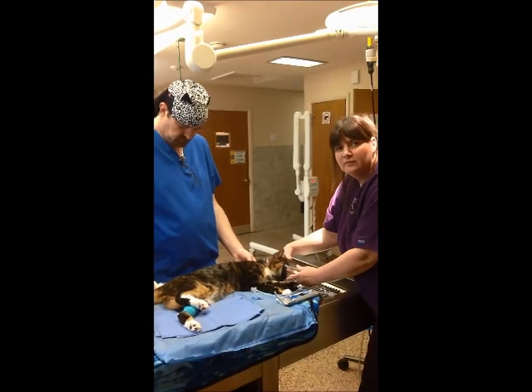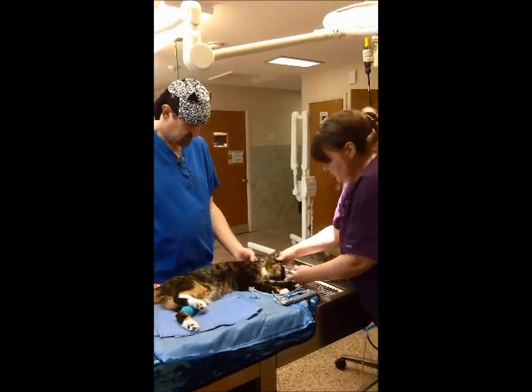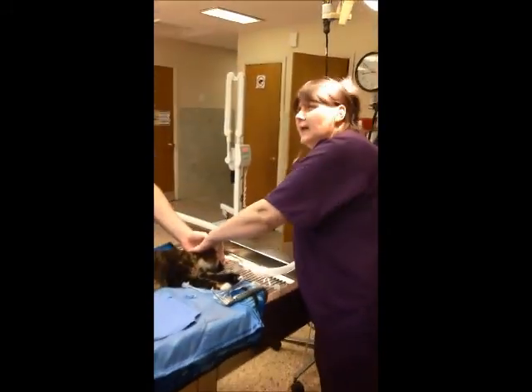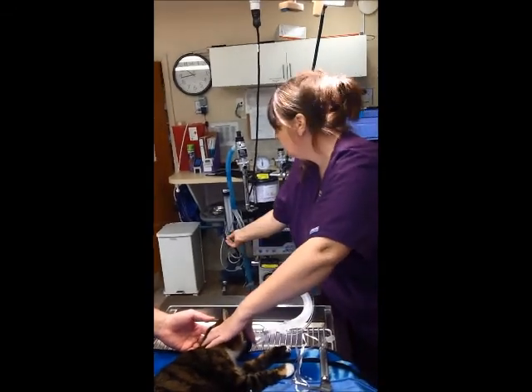We did Scarlett for her dental today, so she's been on sevoflurane for a few minutes. She was on pure oxygen first, and then we switched her over to sevoflurane.